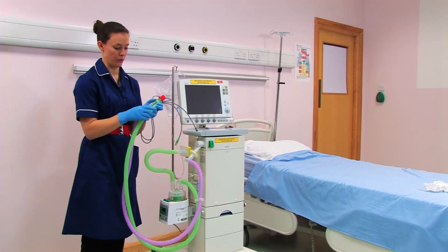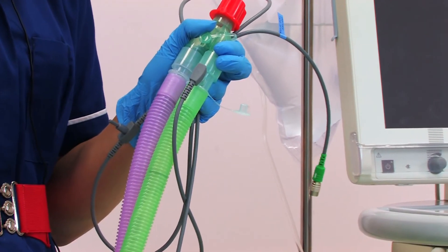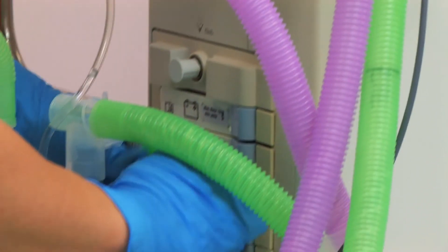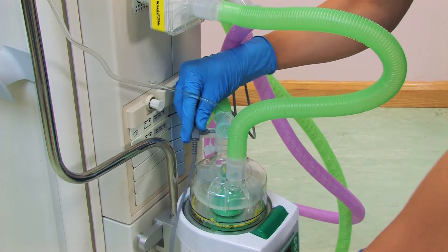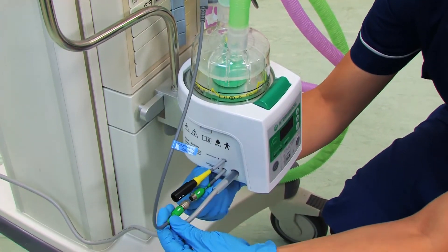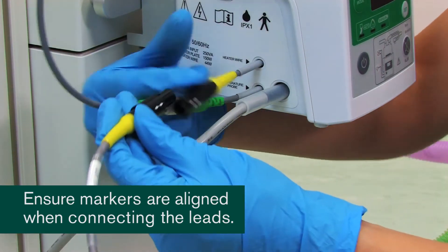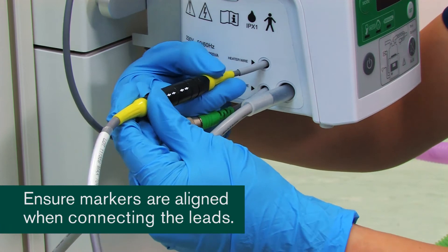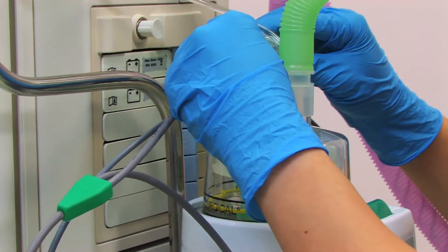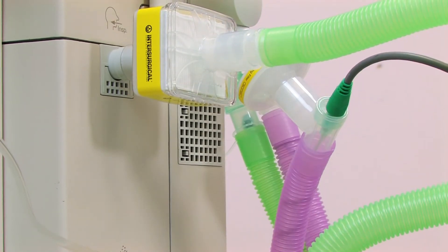Now connect the temperature probe. Connect the heated wire adapter. Connect the clover leaf to the inspiratory limb. And the oval connector goes to the expiratory limb.